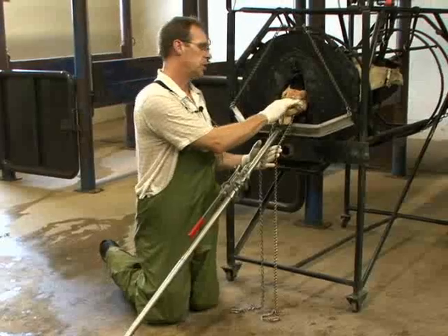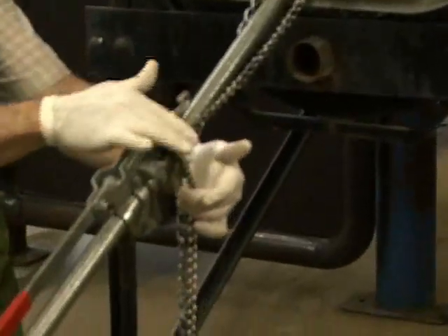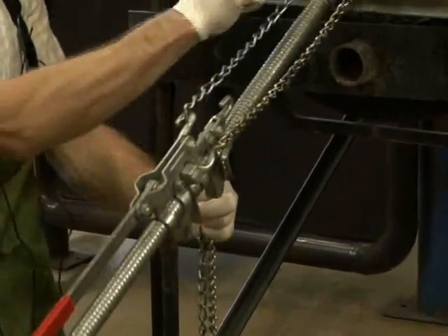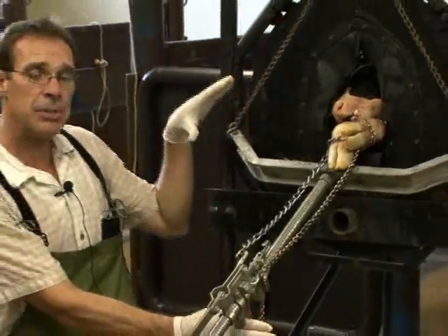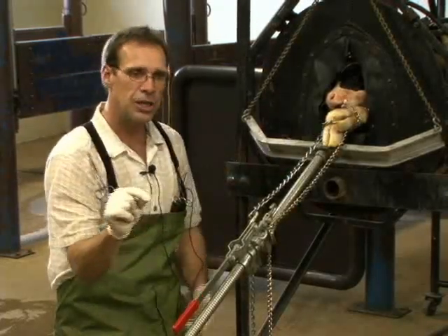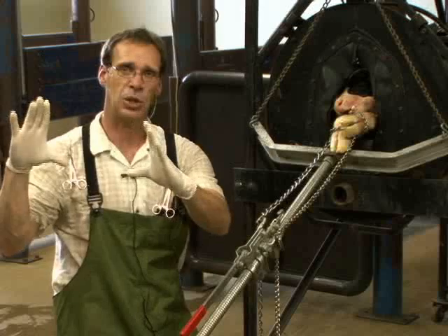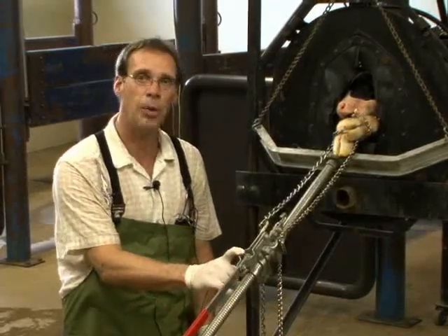The first thing we do is put the chains in place and attach them to the hooks on the calf jack. This is a dual ratchet calf jack, so for every crank on the handle, we pull one leg first and then the other. This is very important because the largest diameter of the calf coming through the birth canal is the shoulders. We want to pull one limb first to clear that shoulder, then pull the second so we don't bring both shoulders into the birth canal simultaneously. We want one shoulder to clear first, then the second.